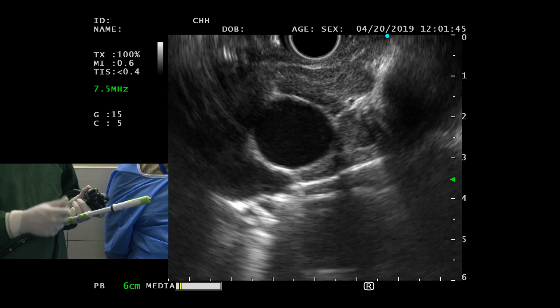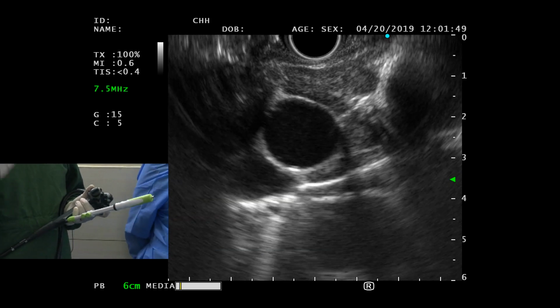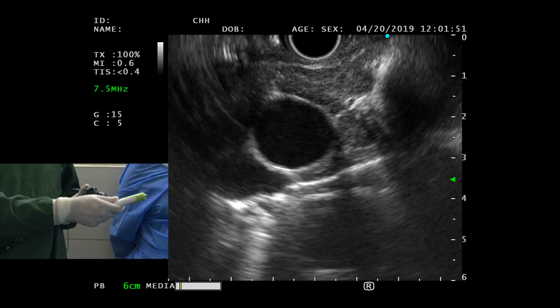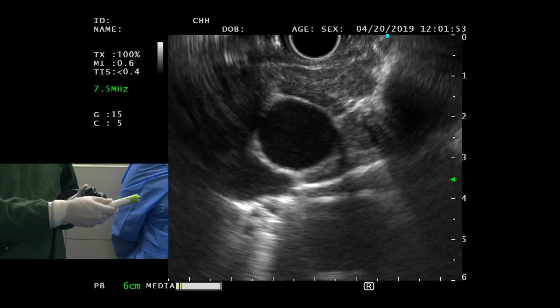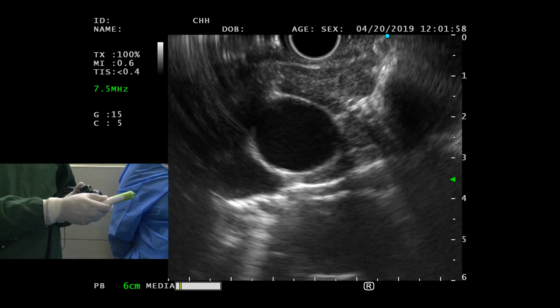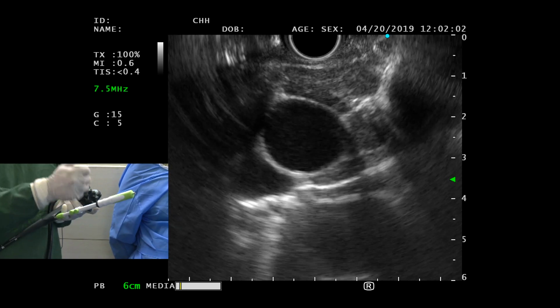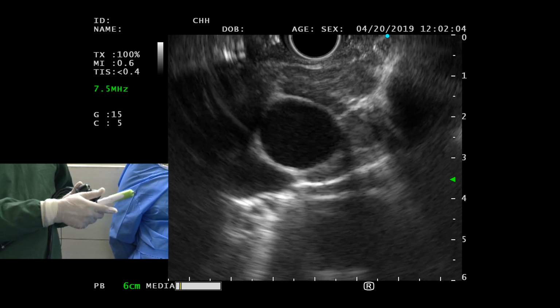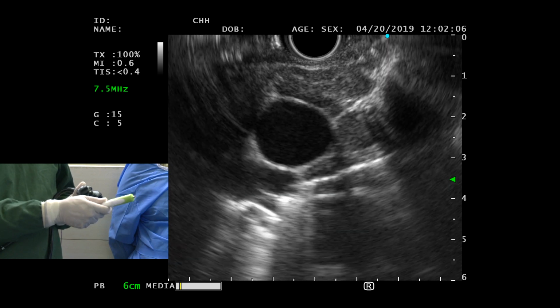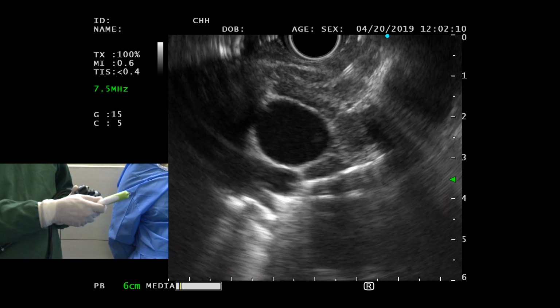So it is important, and one of the things that we have to be very careful with, and this is totally for our part of the world, is when you take this needle out and it does not come out, then you need to stop and reposition your sheath. Do not keep on pushing, forcing the needle, otherwise you will actually cause problems with your scope.